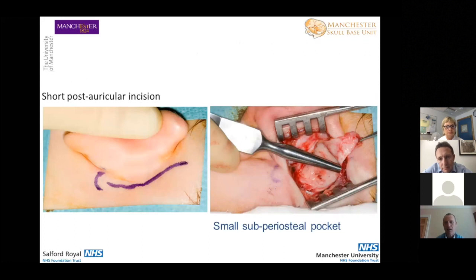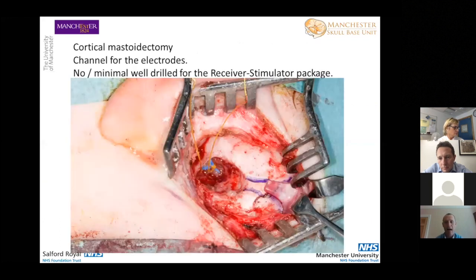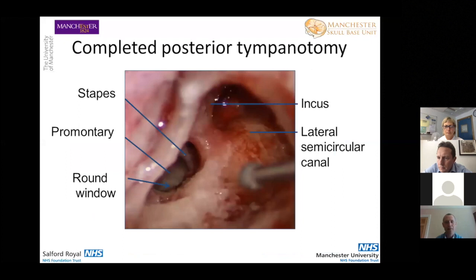Here's just an image of the standard small post-aural incision with a narrow subperiosteal pocket that's designed specifically to fit the implant itself. And then here is a silastic template that we use to check the pocket is correct. And then we tend to mark where we're going to drill and drill the channel. We used to drill a well, but modern implants have a much flatter profile, so they don't need a well generally now.